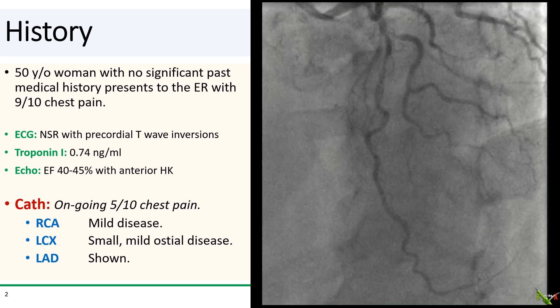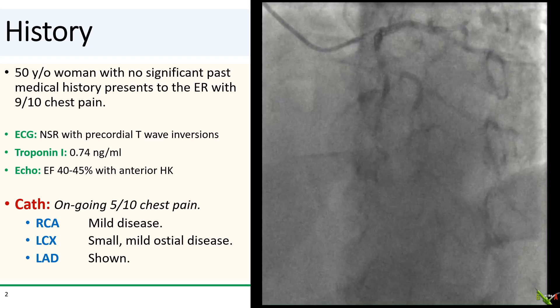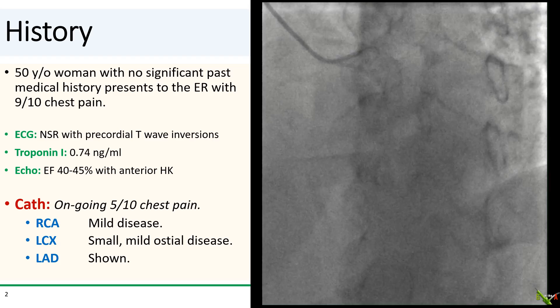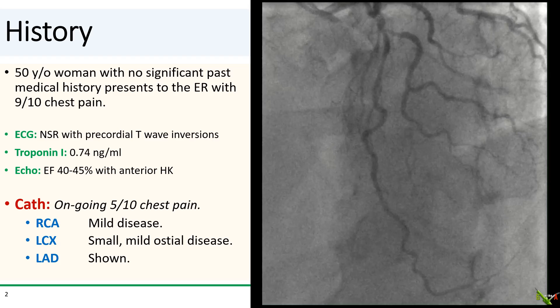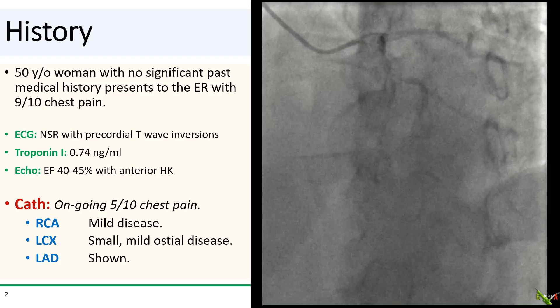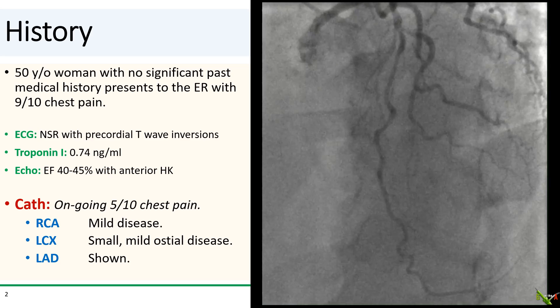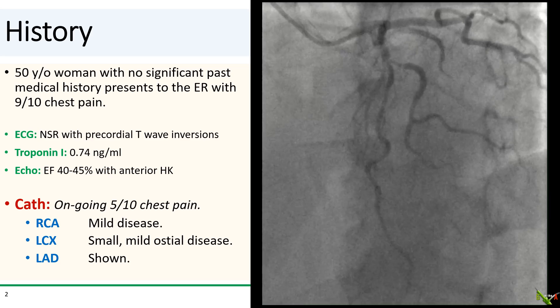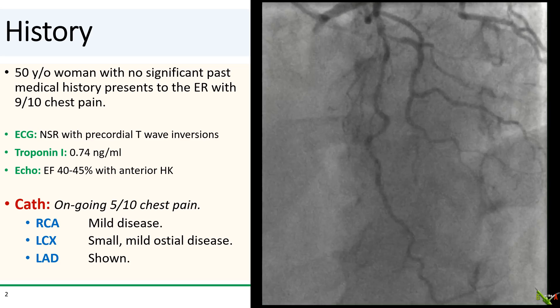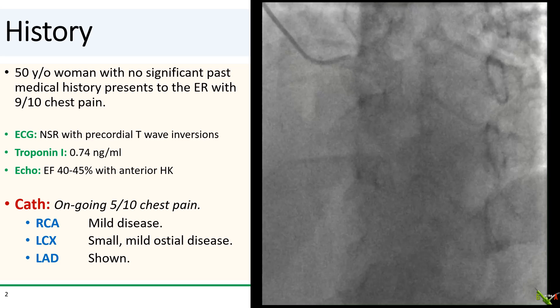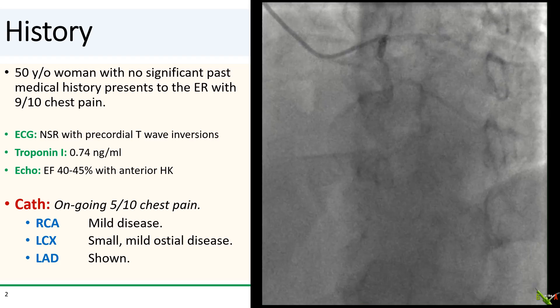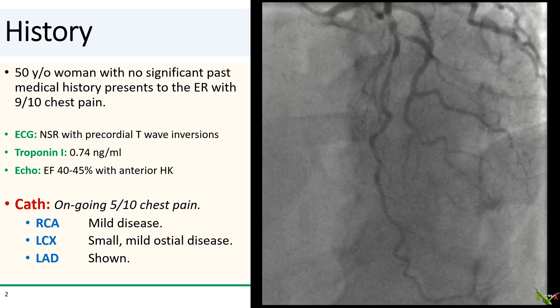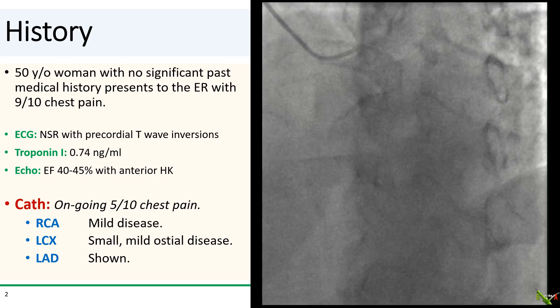In the lab, she had ongoing 5 out of 10 chest pain. The RCA and circumflex both had only mild disease. The LAD is shown, and we see a severe stenosis at the ostium of a very large second diagonal branch, as well as a haziness in the mid-LAD.